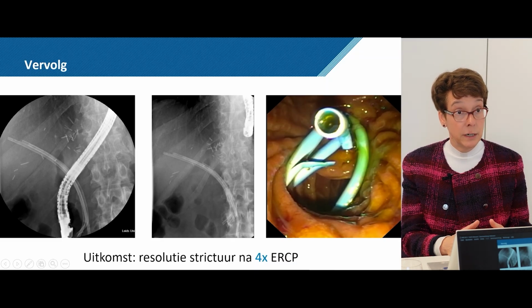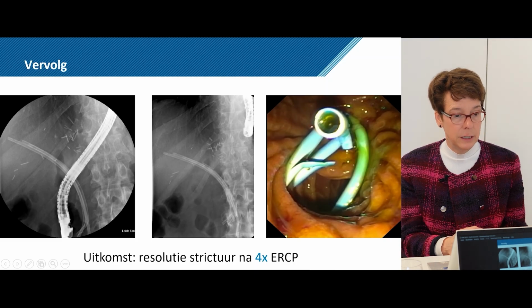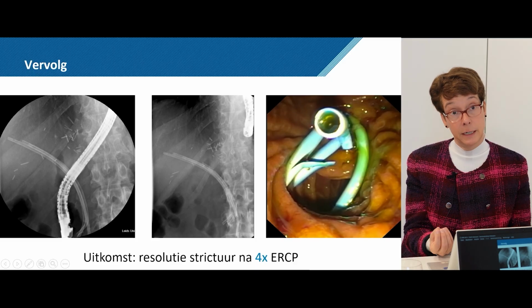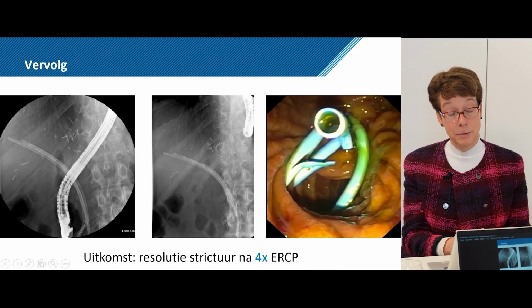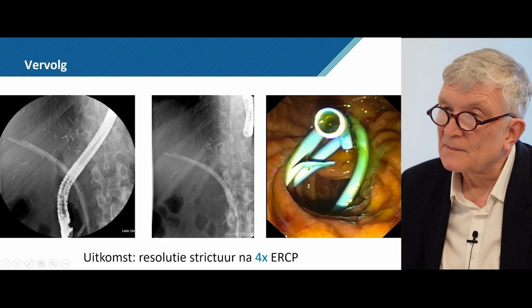And sometimes that's already cumbersome. You end up with these 7 French endoprostheses to put in. And then we schedule them on a regular basis to see if we can upgrade. Because the argument we hear is that a stent is a source of infection. That's true. But with any ERCP, and maybe even before, there's infection anyway. So it's difficult. As soon as we go in with the ERCP, we do infect this biliary tract. And then we see if we can settle it with plastic endoprostheses.